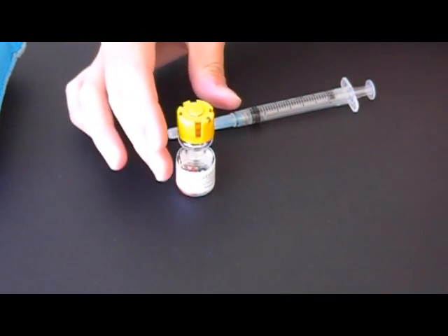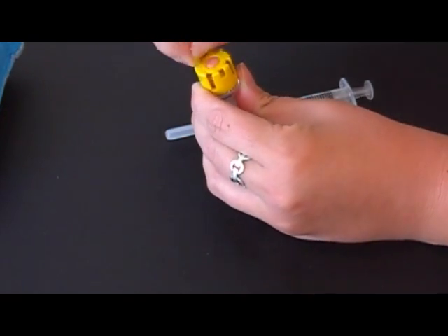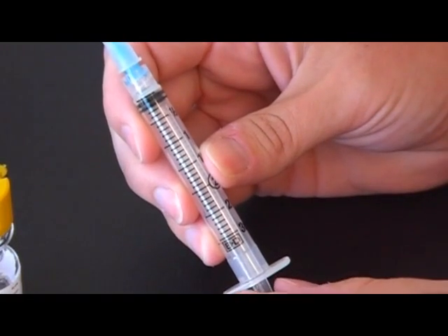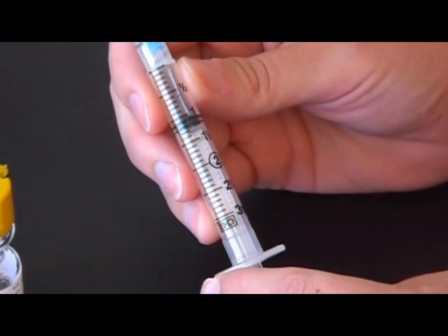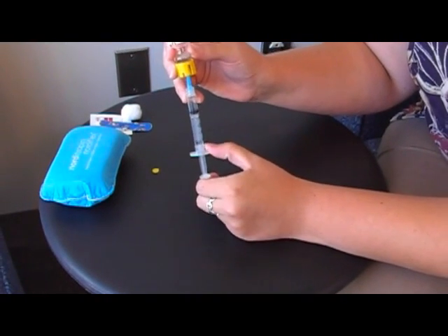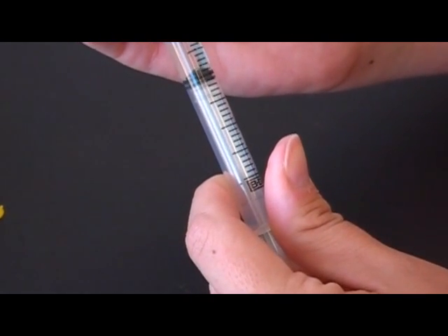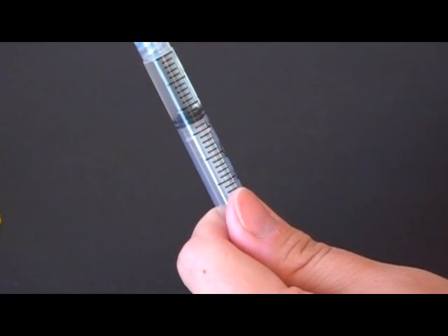The next step is to draw up the medication. The center part of the lid, the small circle, pops out — don't try to remove the whole lid. Take your syringe and needle and draw up air in the amount of medication you'll be giving: either half a cc, one cc, or two cc's. Remove the cap from the needle, stick the needle into the center of the stopper, turn the vial upside down, inject the air, and draw back the medication. Pull back a little further than what you need, then remove the needle from the vial. It's okay if there are some air bubbles — we'll get those out later.